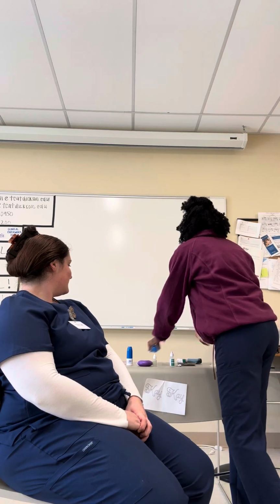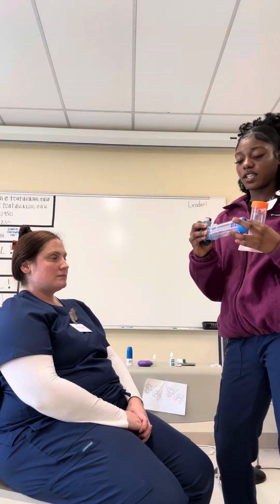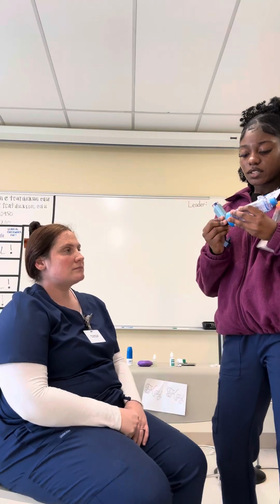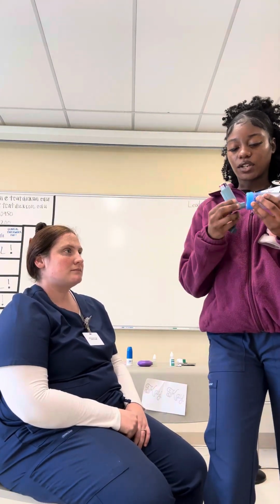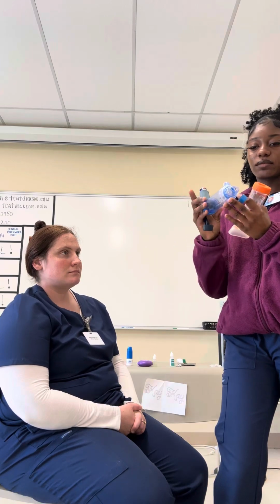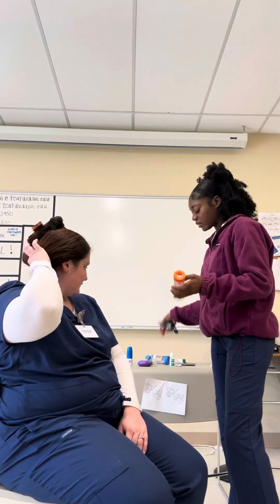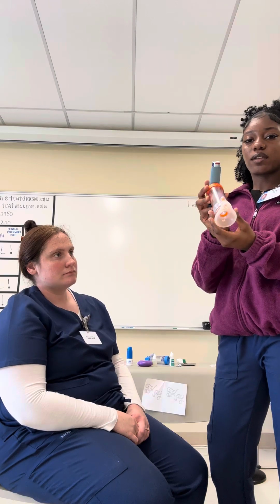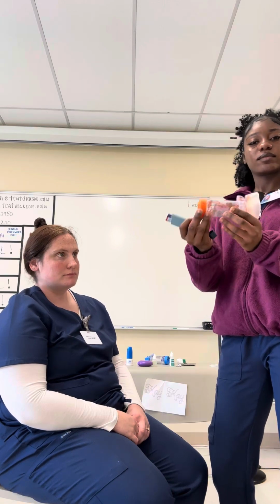And then also for the meter dose inhalers, these are things called spacers. And in this case, you would use this for pediatrics or geriatrics. So you would just fit the actual inhaler into this spot, and it's really the same concept. Have them have this on their mouth, inhale, push down, and same thing. And then with this pediatric spacer, same thing. You would place this part on the baby's face, and then you would press down. And that is it.